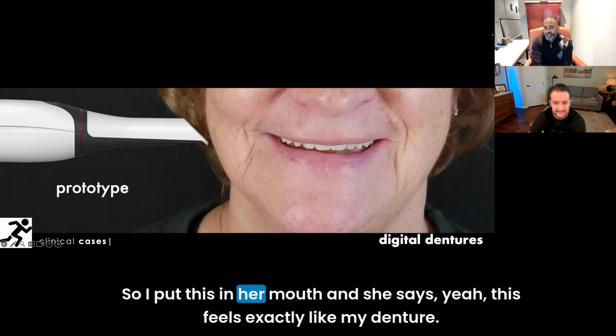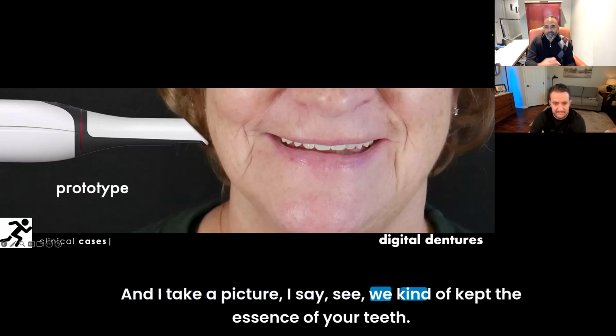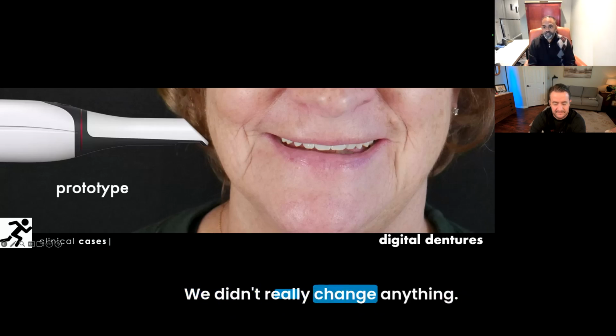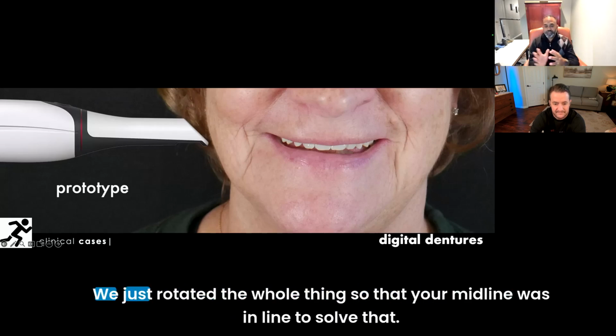So I put this in her mouth, and she says, "Yeah, this feels exactly like my denture. This is great. This doesn't feel like horse teeth. I'm really excited." And I take a picture. I say, "See, we kind of kept the essence of your teeth. We didn't really change anything. We still kept it a little unique, a little asymmetric. We just rotated the whole thing so that your midline was in line."